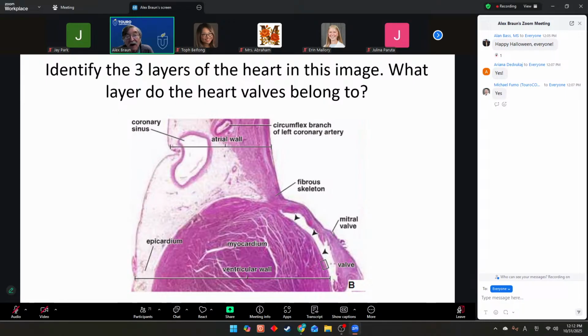The visceral pericardium, which is also called the epicardium. Now, this specimen of heart has been removed from the pericardial sac, so we no longer have a parietal layer of pericardium to look at in this picture. We really no longer even have an obvious pericardial cavity to look at in this picture, but I easily see the visceral layer of pericardium, which we also call epicardium. Often we'll simply call it epicardium. So here's that fatty layer, which is the epicardium. On the surface, there will be mesothelial cells, which secrete that lubricating fluid again.